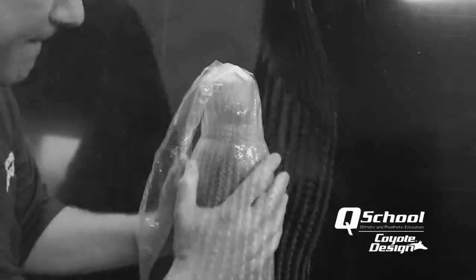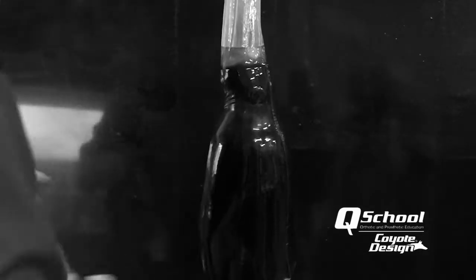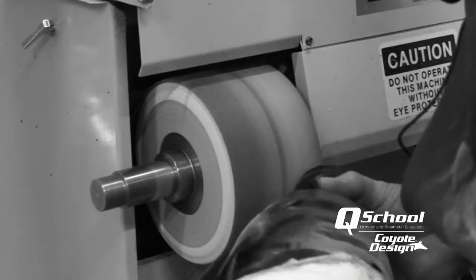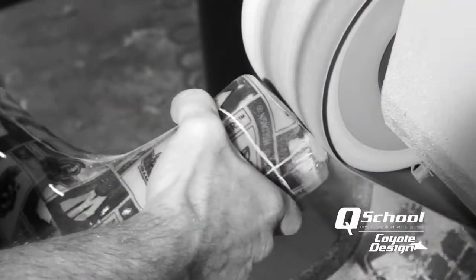The desire to switch from carbon fiber to something else started well over two decades ago. As a technician for our patient care office, I did a lot of work with carbon AFOs — essentially doing all the lamination and setup through the morning, getting as many ready to grind and finish at once so I was only itchy at the end of the day. Regardless of suiting up in some sort of hazmat outfit or applying lotions to our arms beforehand, it was inevitable that you'd be itchy and irritated.